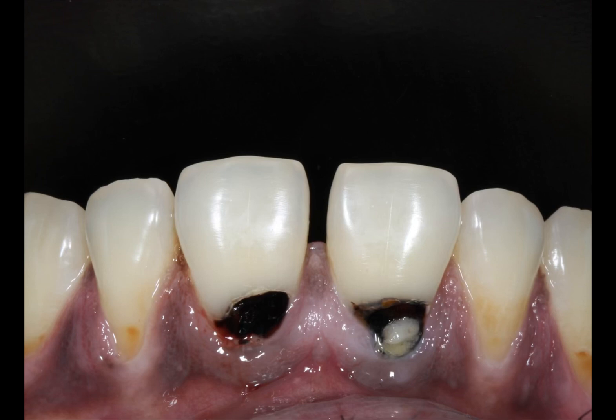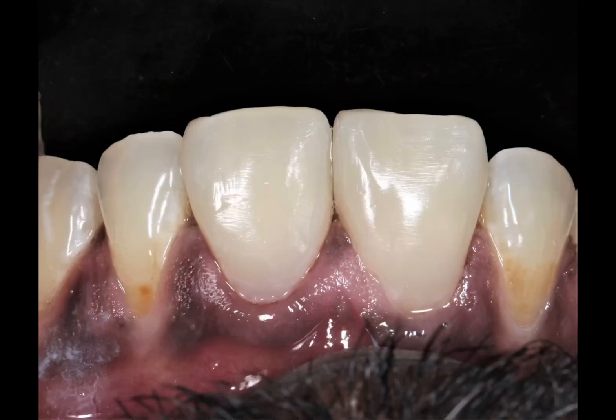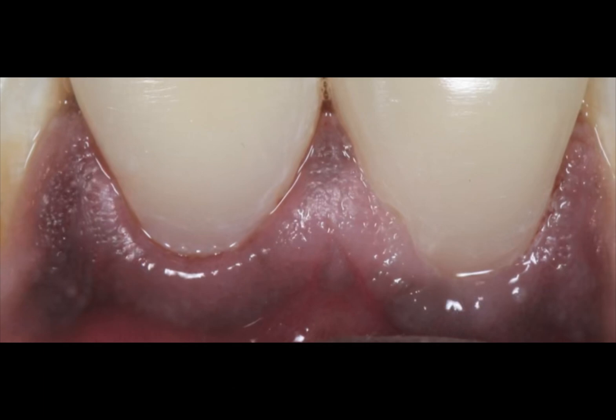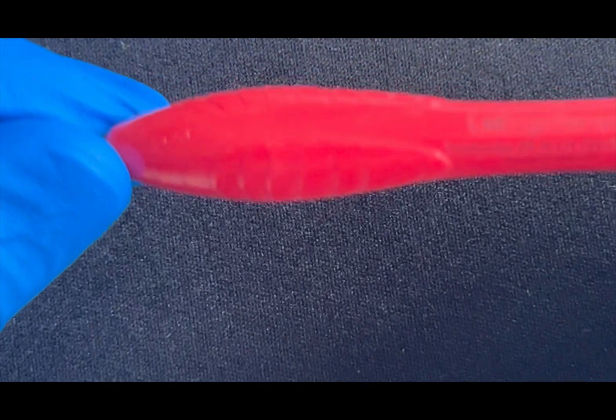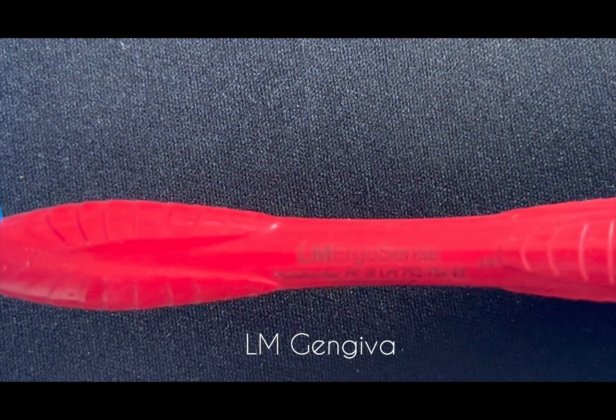I'm showing you another case which has a labial defect which is subgingival. I have used a unique instrument to retract the gingiva, isolated from moisture, and bonded with composites to get a beautiful restoration with adequate seal and integrity with soft tissues. The instrument I used is an LM Gingiva, and this is how it is.